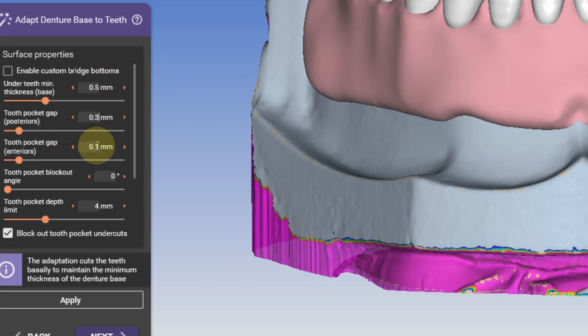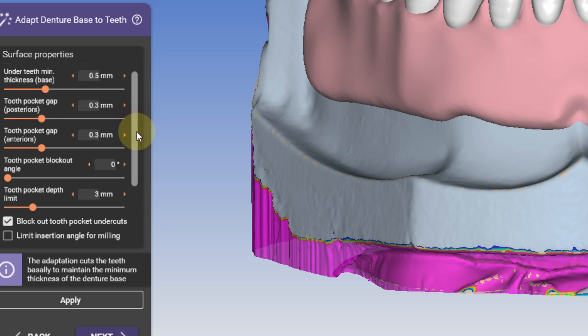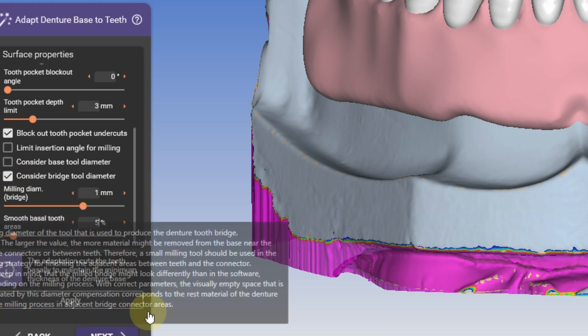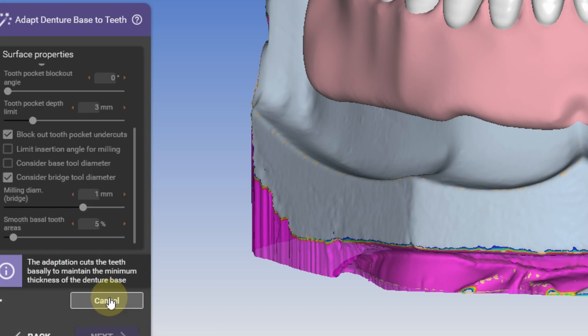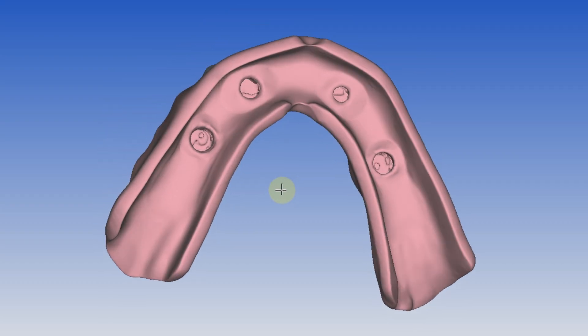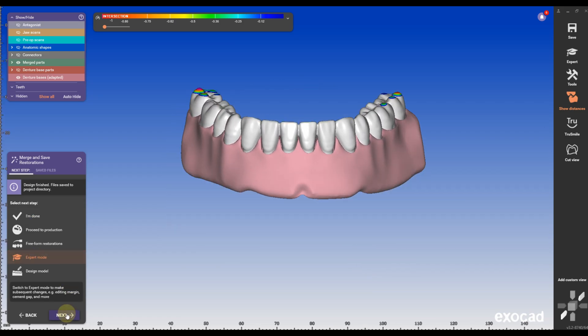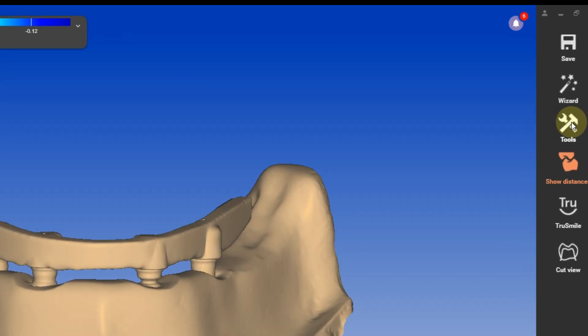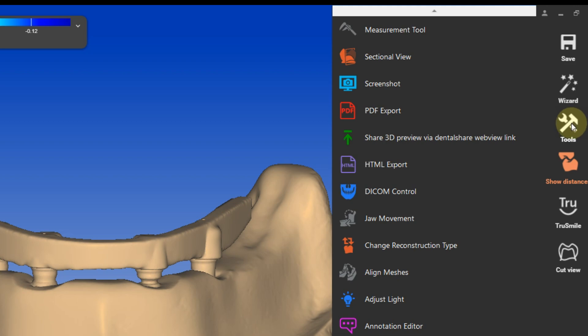These are my preferred settings to adapt the denture base to the teeth — you don't have to follow them, but they work best for me when milling the teeth. If you want to print the teeth, uncheck 'consider bridge tool diameter.' If you want to mill the teeth, you have to check that box. Click OK and apply, and the denture base entities are adapted. The next step is to import the bar design that we exported in the bar design step — go to add/remove mesh and bring in a generic mesh, then load the bar itself.